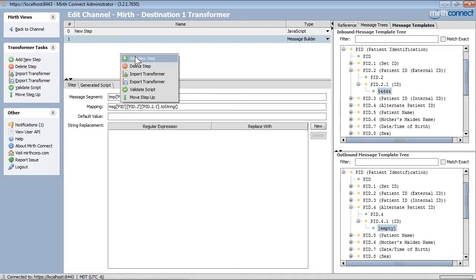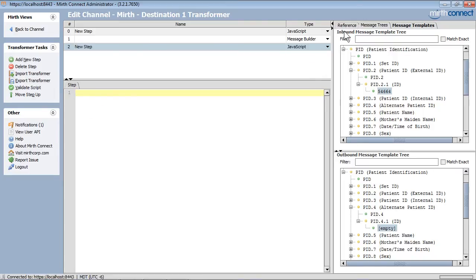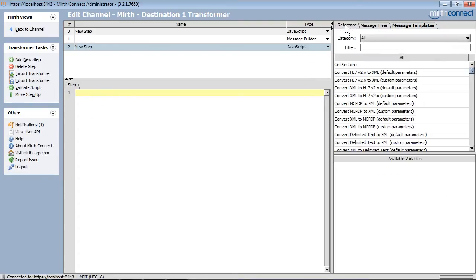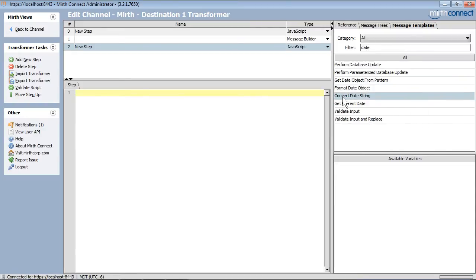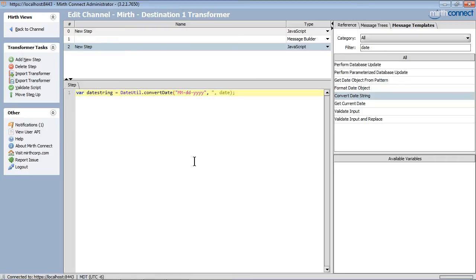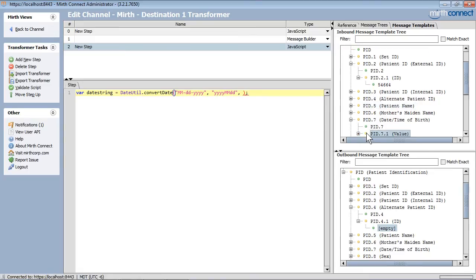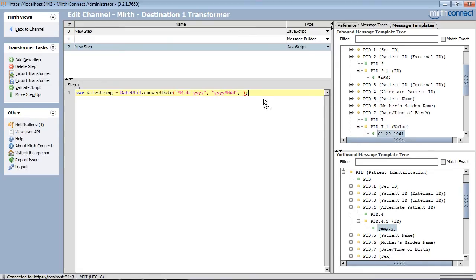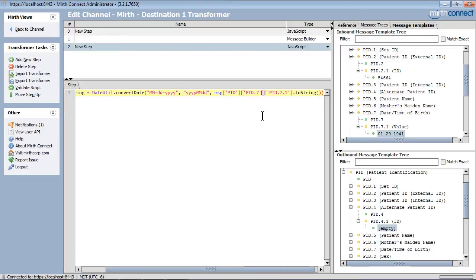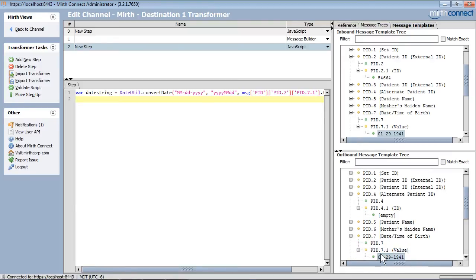I can now copy the patient's ID from PID2 to PID4 in my output message. The next mapping will be to reformat the patient's date and time of birth. We will need to do some JavaScript code in order to perform this step, getting the date from the inbound message from PID7 and putting it back into the outbound message in the same field with the reformatted date and time.